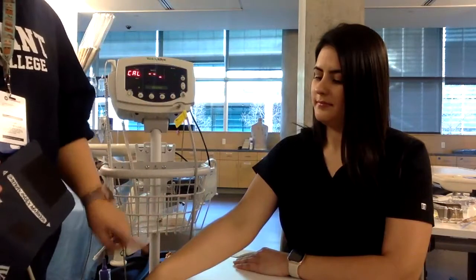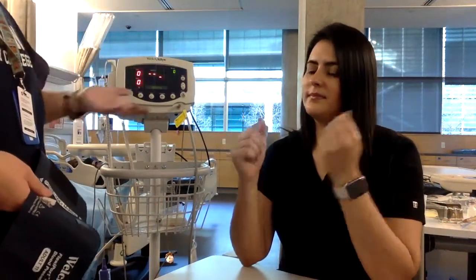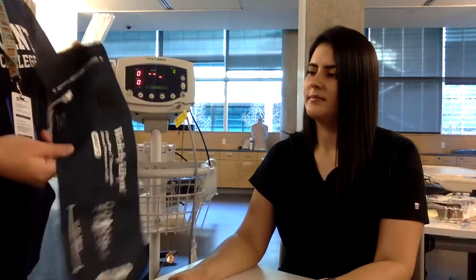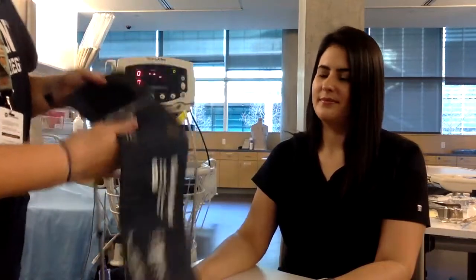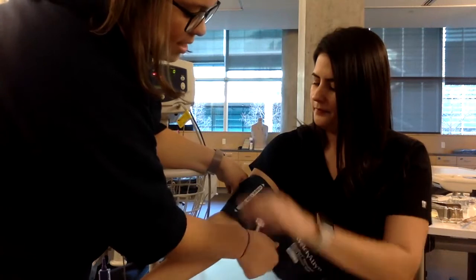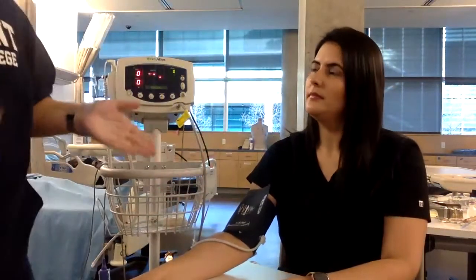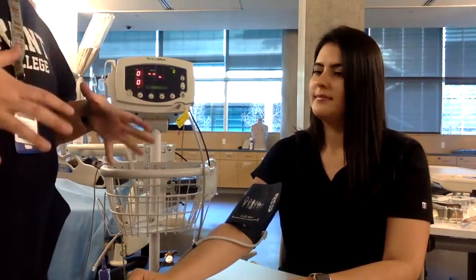You want to make sure the patient doesn't have any limb precautions. Most hospitals will have a band — sometimes pink or other colors — that says do not use this arm. There could be a special IV, dialysis access, or a mastectomy on that side. I also try to use the arm without the IV. Find the marker arrow on the cuff and make sure it's pointing toward the artery. Tighten the cuff snugly — not too small and not too big, because that could skew your results.